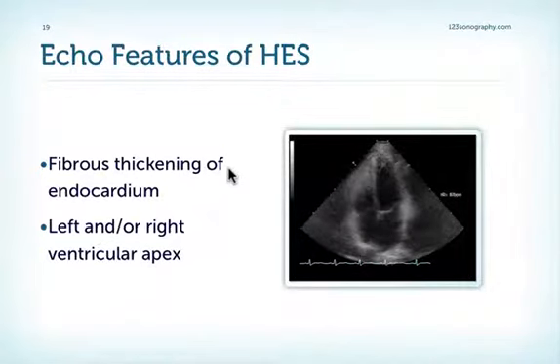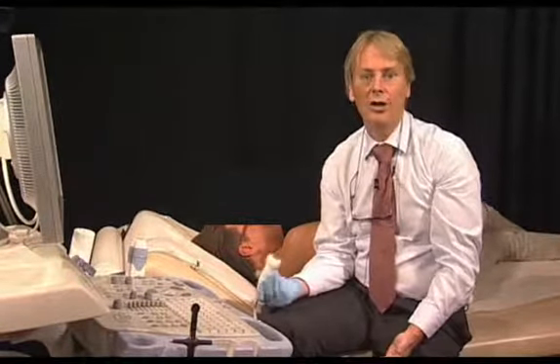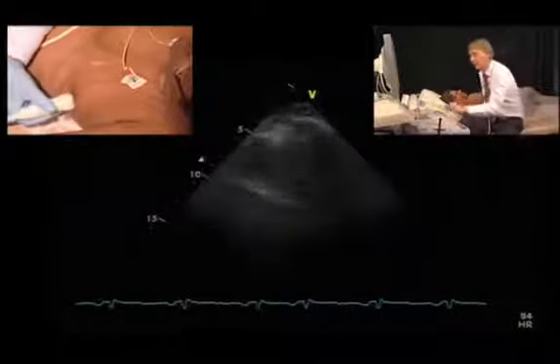Now I want to go to our patient and show you his diastolic function. In patients with endomyocardial fibrosis, we often have myocardial involvement. So we do see both diastolic and systolic dysfunction. Let's look at the diastolic function of this patient with endomyocardial fibrosis.